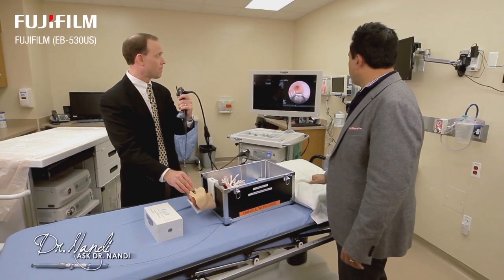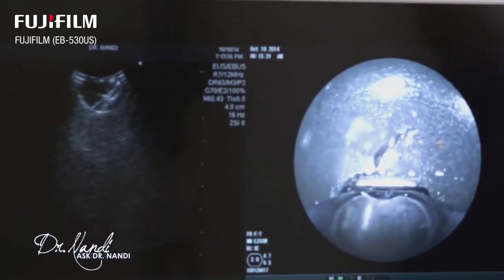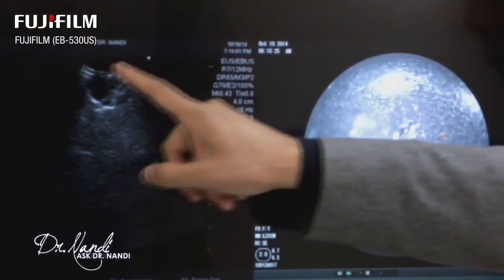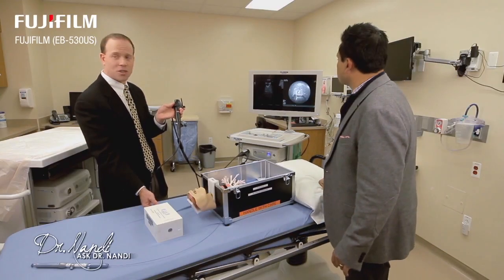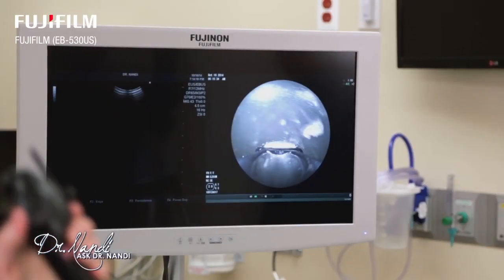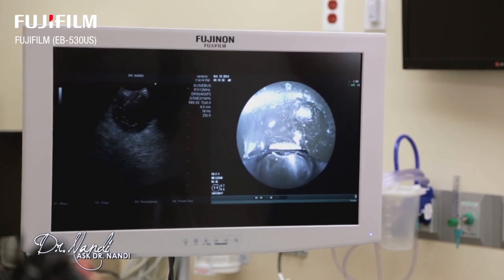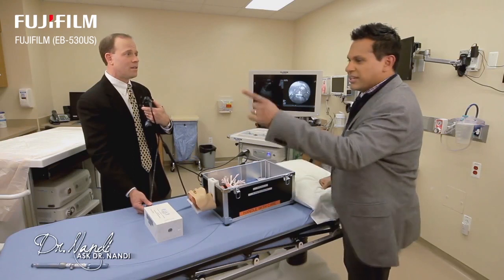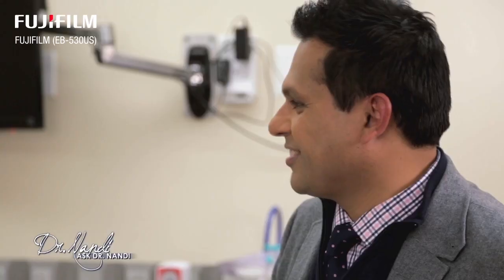Okay. Can we show them maybe an image of what an EBUS would be? Right at the top of the screen is what is supposed to be a lymph node. Correct. It has a round structure, and it would normally be darker inside than the surrounding tissue. We would try to find these lymph nodes, and I'll see if I can find another example that looks a little bit more discrete like that. Yeah. So we'd come up to these lymph nodes, and then people at home are saying, I can see that. And then we would figure out a way to biopsy them.